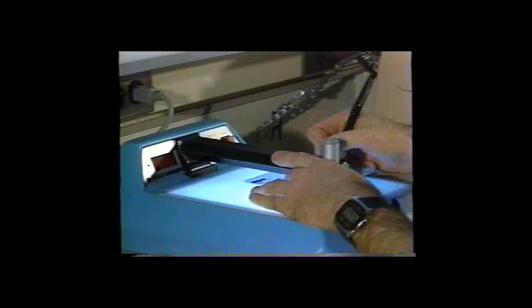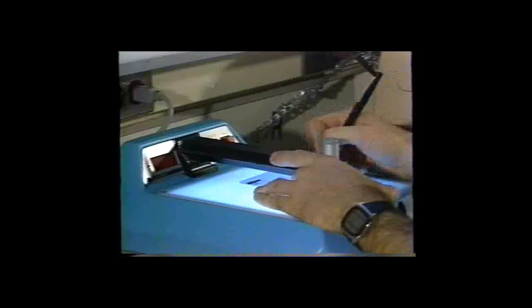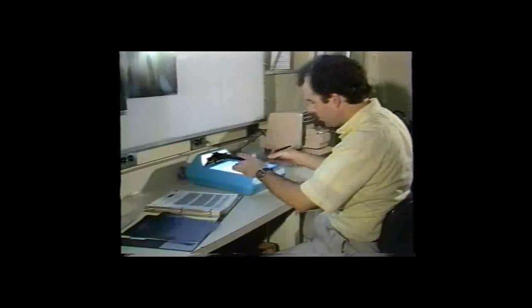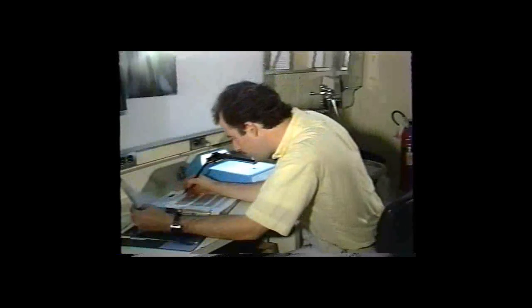Traditional methods require using both a sensitometer and a densitometer for process monitoring. The technician must take several readings, record each one, then calculate base plus fog, speed index, and contrast index, and enter those numbers on a control chart along with processor temperature.